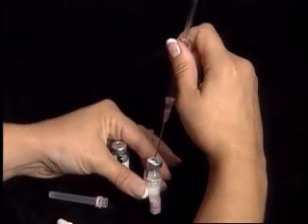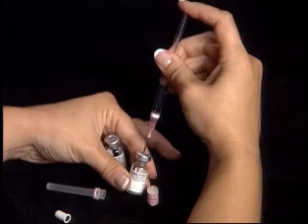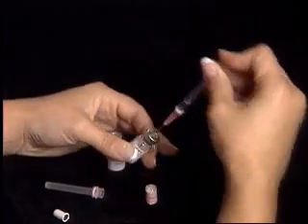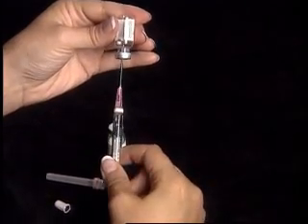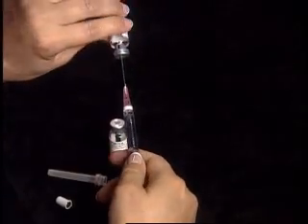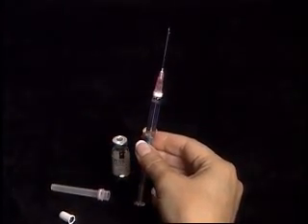For demonstration purposes only, we are mixing two vials. Repeat this process using the newly mixed medication to dilute the next vial of powdered medication. This will increase the dosage without increasing the liquid volume.